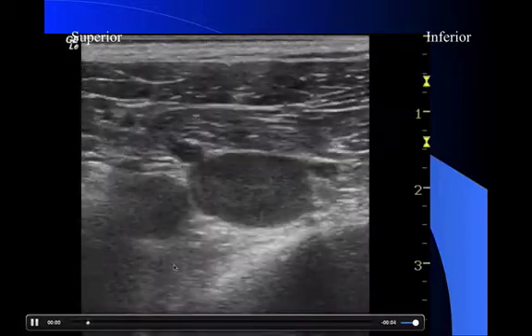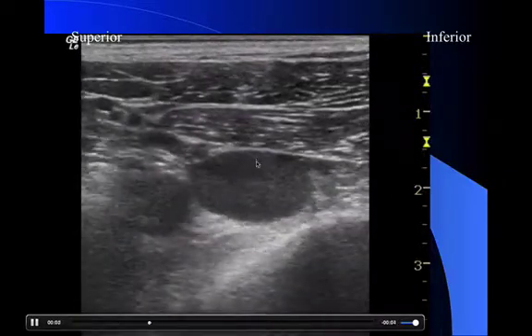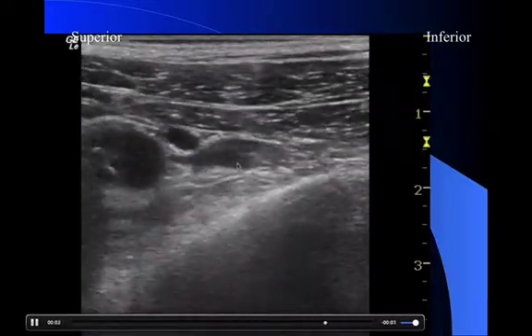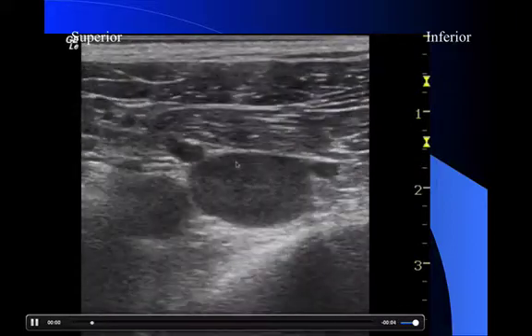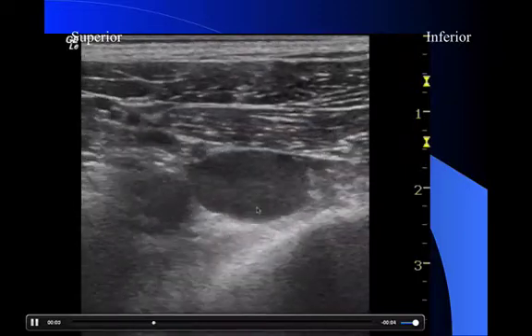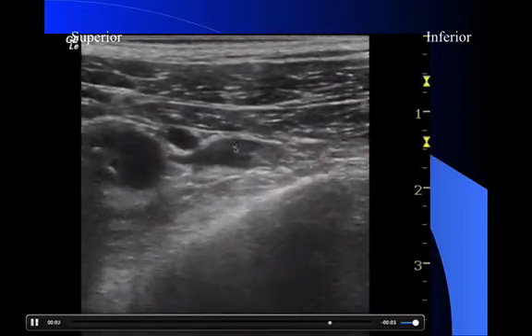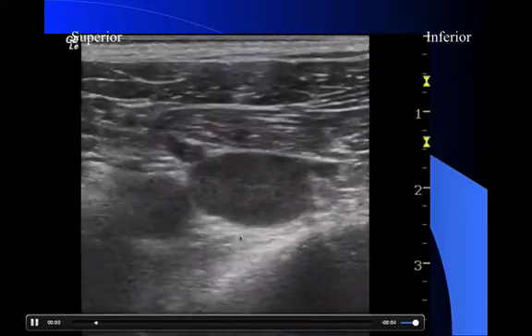This right here is pleural line, and you can see how close it is to the vein, and you can imagine doing this procedure blindly. As scary as it may seem, doing it with ultrasound, it's more scary to do it blind, as there's not a big gap between the subclavian vein and the pleural line here.